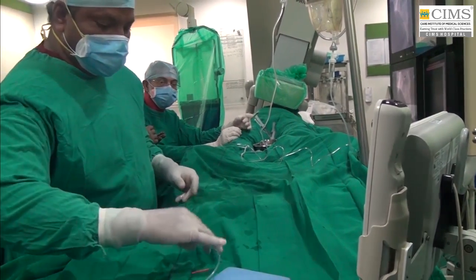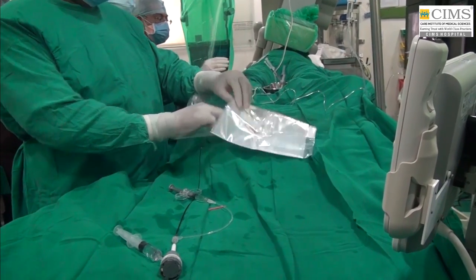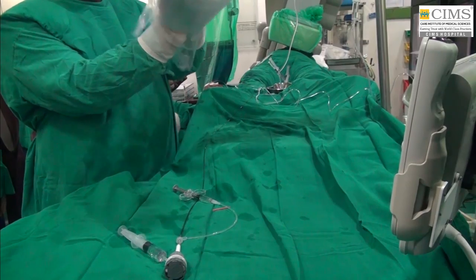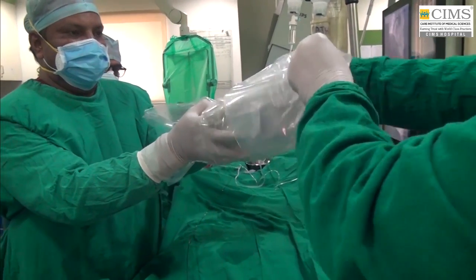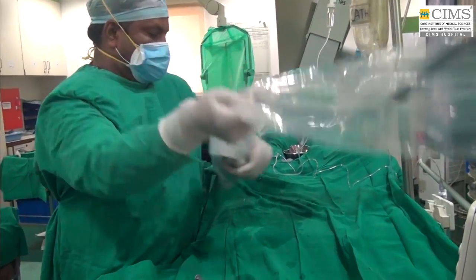And when it's purging, you will see a small jet at the tip of the catheter. Second thing is proper sterility. So you have to use a sterile cover to connect it with the dock. It's called the dock cover. And through the dock, we connect it to the console.